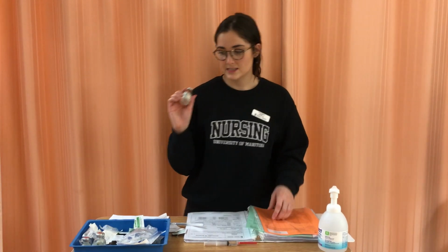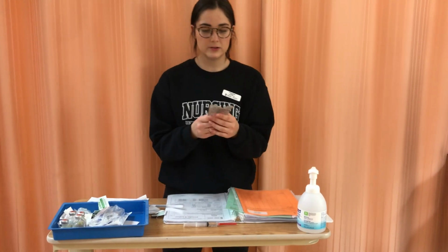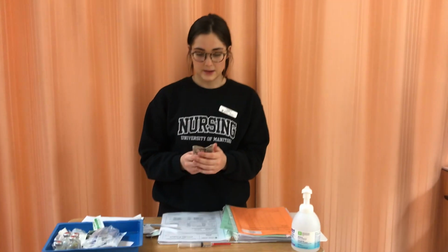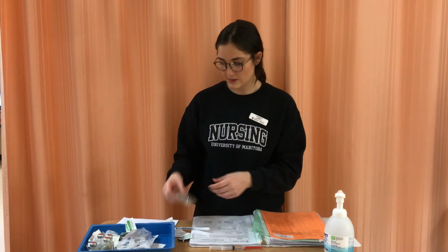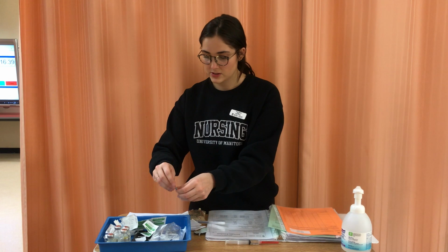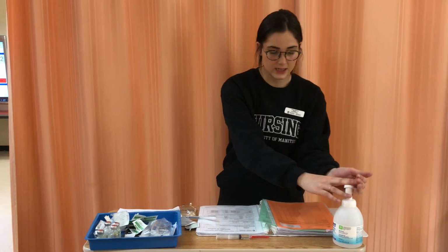Okay, so now that we're done with this, I'm going to put these both in the disposable waste container. And I'm going to grab my diluent. So I chose 50 milliliters of normal saline, just because our patient's not dehydrated, so we don't need to give them extra fluid, so that's why I chose 50, and normal saline because they have no nutritional requirement for D5W at this time. And I'm just going to make sure it's intact and it's not expired. So I'm going to swab this for 30 seconds and let it dry for 15.